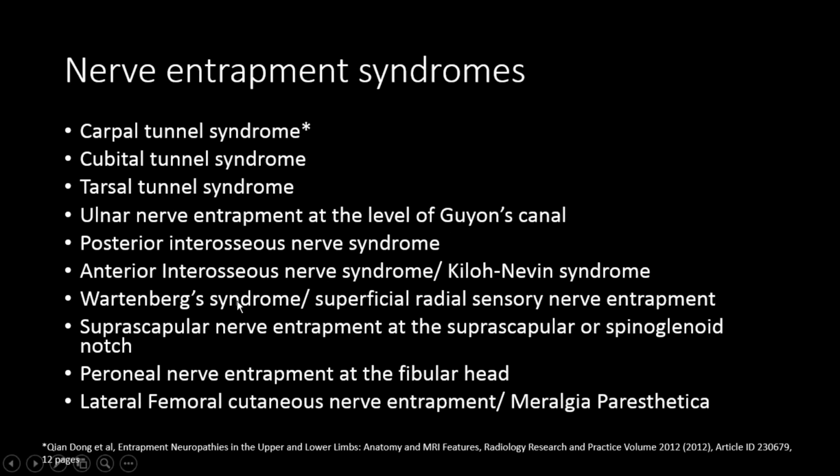Now, in the last webinar, we covered the first three entrapment syndromes. The most common entrapment syndrome in the human body is carpal tunnel syndrome, and we covered carpal tunnel syndrome scanning techniques, cubital tunnel syndrome, and tarsal tunnel syndrome in the last webinar.